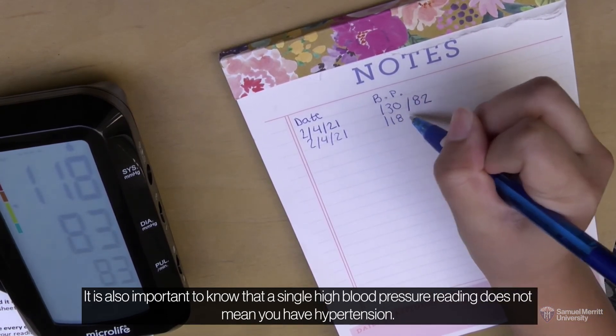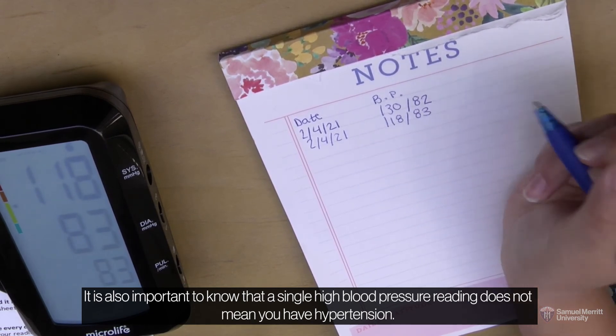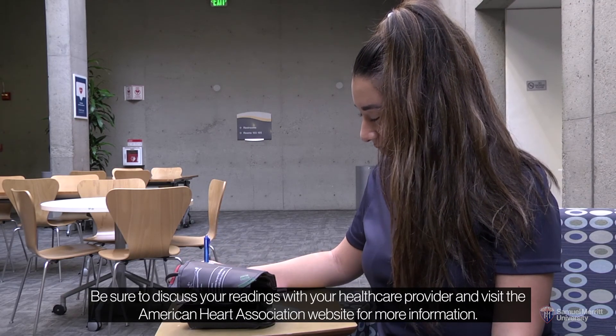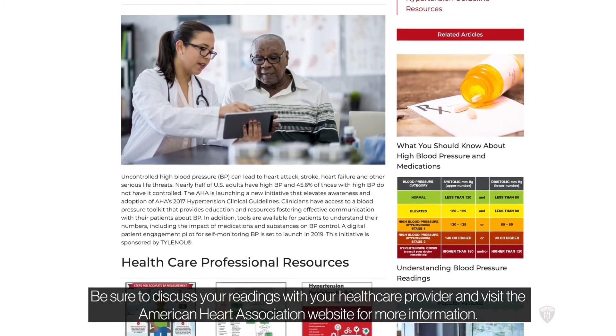It is also important to know that a single high blood pressure reading does not mean you have hypertension, but it can be an early sign to follow up with your health care provider. Be sure to discuss your readings with your health care provider and visit the American Heart Association website for more information.